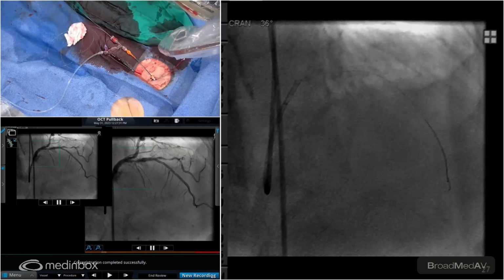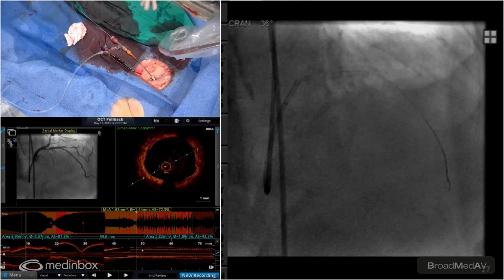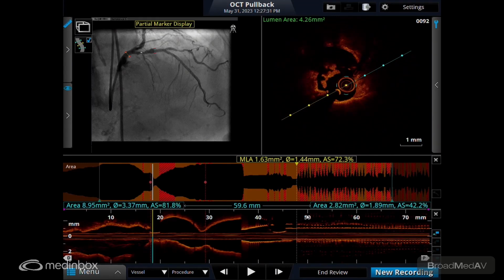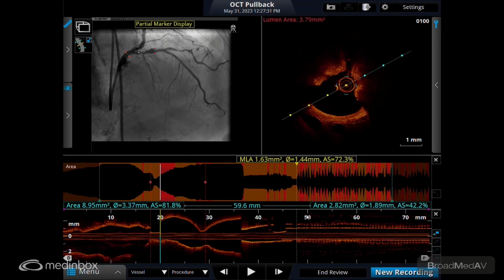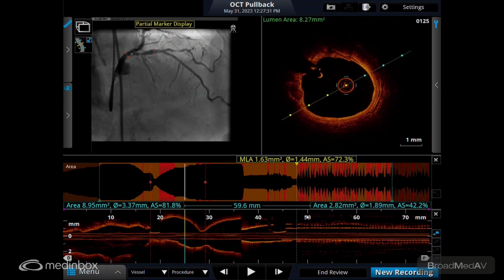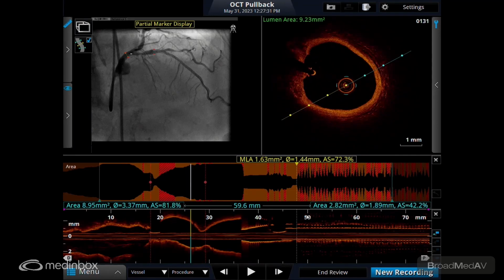Looks good, yeah. All right, so we can start off here quite distally. You can see the calcium already extending, deep calcium there, distal to the vessel of interest. Here's the area that we're coming to where we ablated. Ooh, let's look at the nodule right from above. Deep penetrating nodule all the way. You can't see anything past that. And then not too bad after. No, it's amazing. It really is focal. And there's that ostial part.